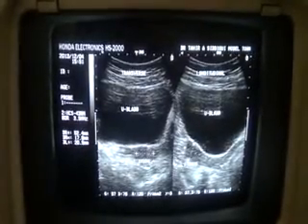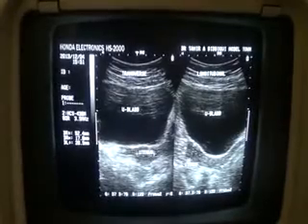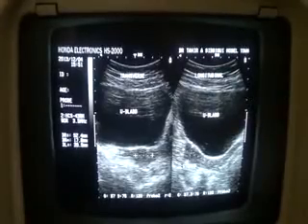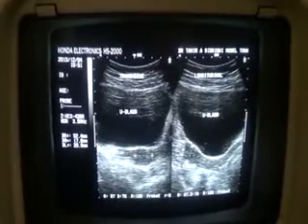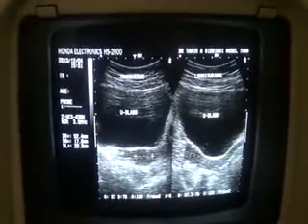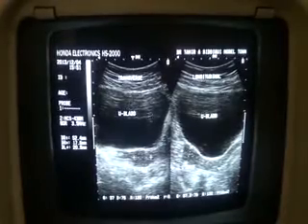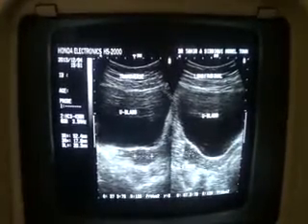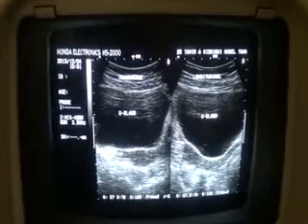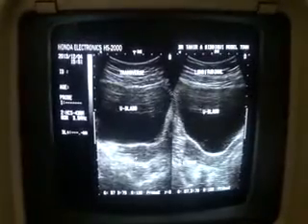Now this is the uterus in transverse section. In transverse section it measures 2.05 centimeters, and this is a hypoplastic uterus. And now we see that the endometrial canal echoes are not visualized. The endometrial canal echoes are not that clearly visualized.